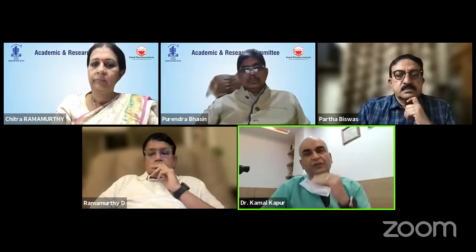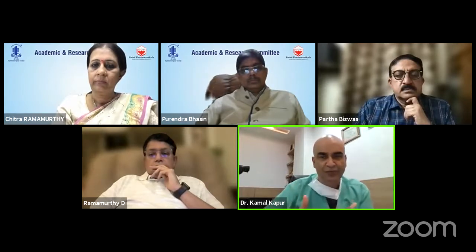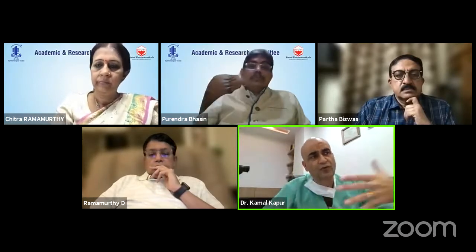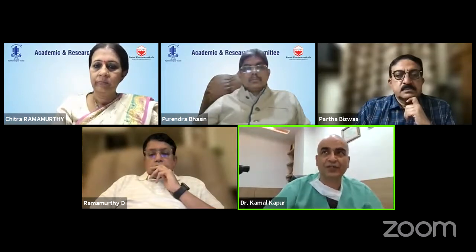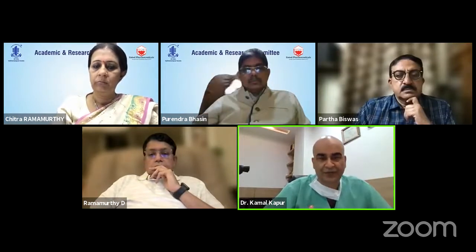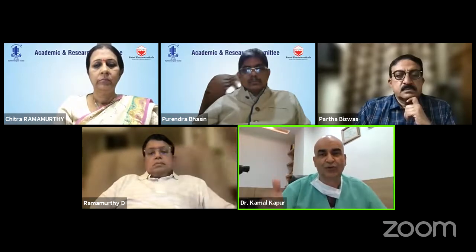I would rather have a cutoff of 3 millimeters, because a hyperopic lens is shaped and designed far differently than a myopic concave back lens. So the golden rule of 2.8 probably doesn't hold true. Yes, but when we are talking on these forums, we are responsible for a lot of audience who are listening to us. So having a 2.8 cutoff is a safe cutoff. But one word of caution for beginners: if you're going to treat a hyperope, do not think below 3 millimeters. Look for lens rise and look for angles.